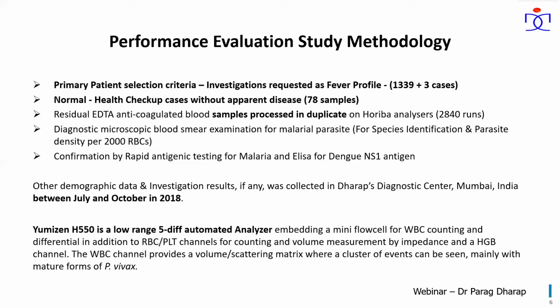Please note that in India, patients have to bear investigation expenses out of their own pocket. So any further testing is decided based on severity of symptoms and socioeconomic status of the patient. So we decided the primary patient selection criteria as all the patients visiting the lab for fever profile investigation. As you see in this slide, 1,342 cases visited the laboratory for fever profile.